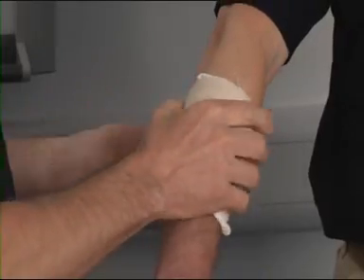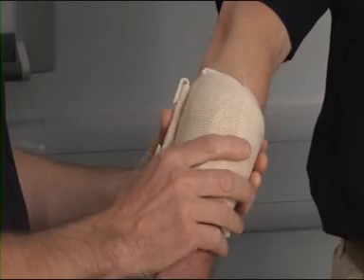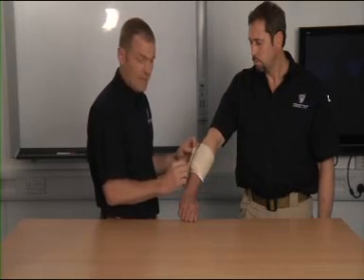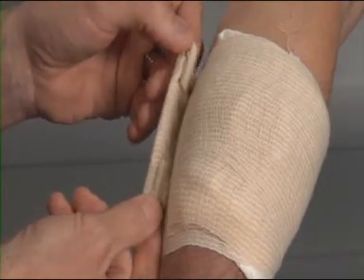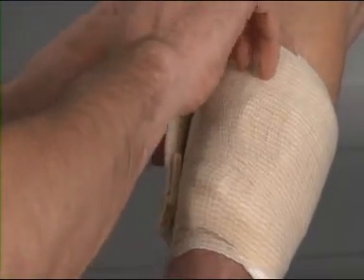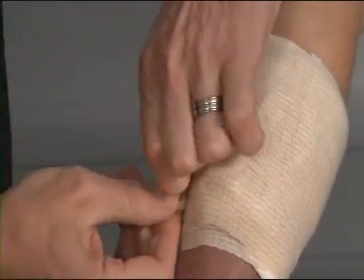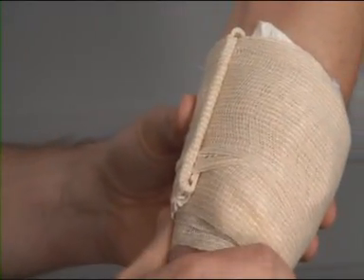At the end of the dressing there's another piece of hook and loop material, and this will just adhere onto the bandage and keep it in place. If I want further security, I can choose to use the plastic hooks that are on the end of the bandage material, and I can simply hook them over a piece of the bandage itself, and that will keep it very firmly adhered.